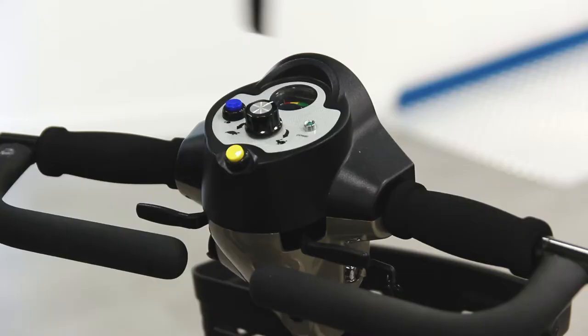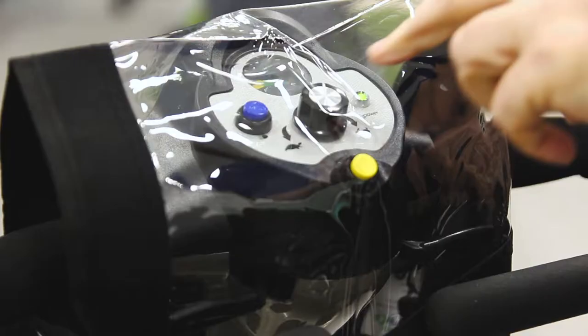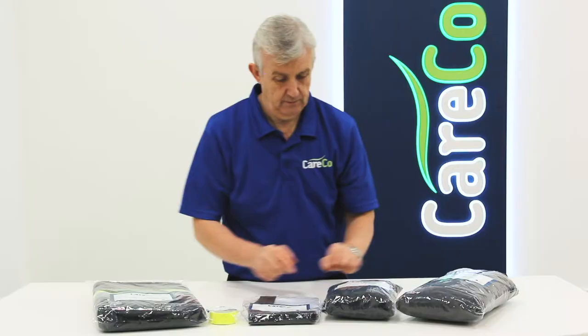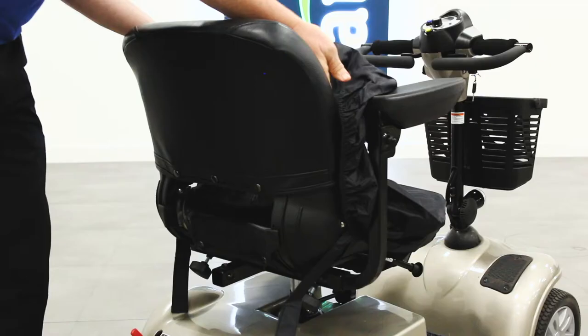The bundle also includes the Careco scooter control panel cover. This partially transparent covering keeps the electronic controls of your scooter shielded from the rain while giving you a clear view of all the buttons, ensuring you can keep the tiller covered while the scooter is in use.